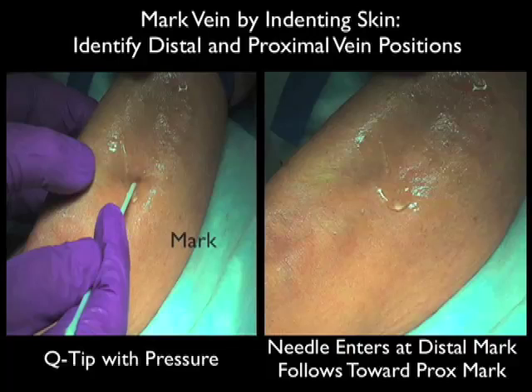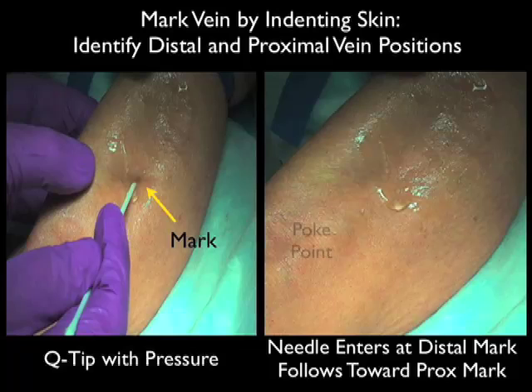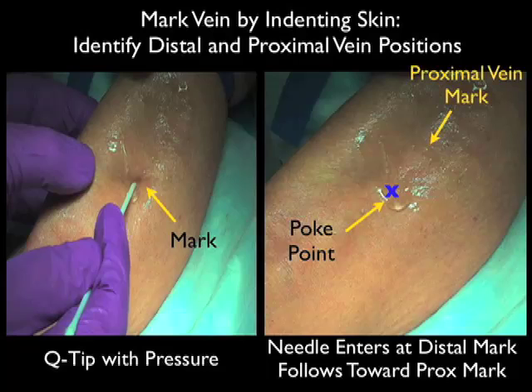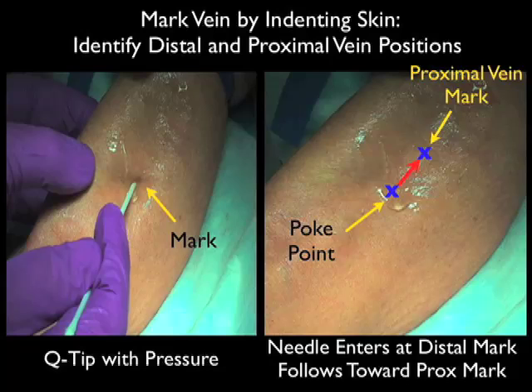To increase the accuracy of an ultrasound-guided IV, it's important to know the course of the vessel as it runs up and down the arm. Here we see that localizing the vessel at one point on the patient's arm is not enough — we need to know the course of the vessel as shown in the picture to the right. Notice we're marking two points on the vessel: the distal poke point, noted by the blue X, towards the outer part of the patient's arm, and then moving the probe more proximally to mark a second point. A line drawn between these marks would identify the trajectory the IV should follow once it comes in at the distal poke point to successfully cannulate the vessel.